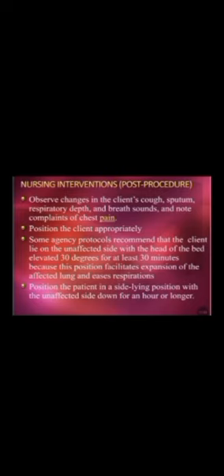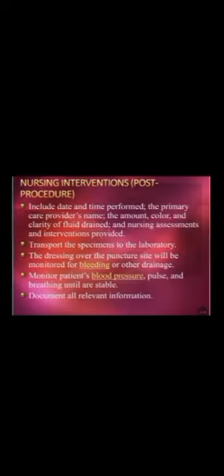Position the client appropriately. Some agency protocols recommend that the client lie on the unaffected side with the head of the bed elevated 30 degrees for at least 30 minutes, because this position facilitates the expansion of the affected lung and eases respiration. Position the patient in the side-lying position with the unaffected side down for an hour or longer. Include date and time.